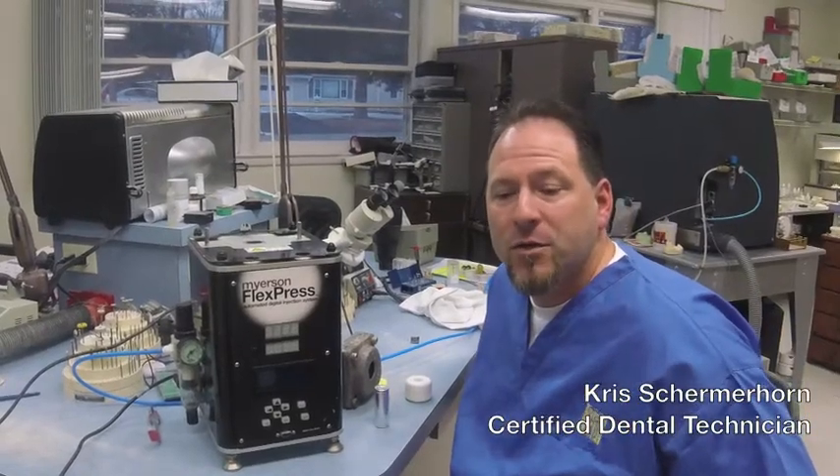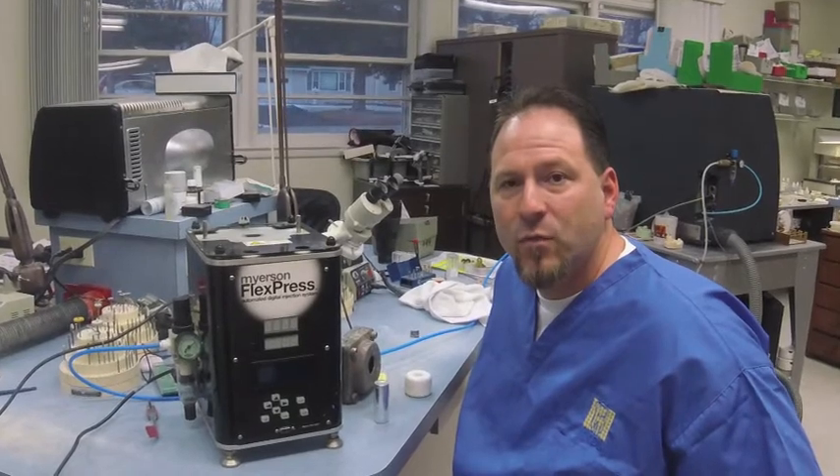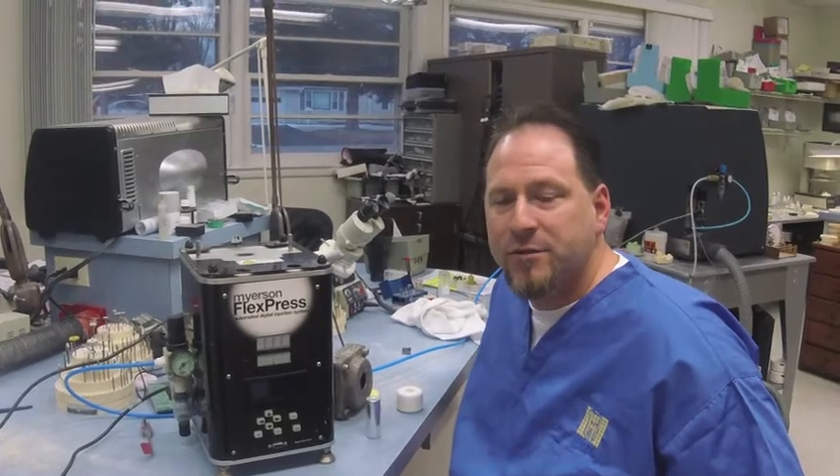Hi guys, Christian Mohorn again. I'm going to go over the introduction to the FlexPress — whenever you guys unpackage it, what you're going to do to run a case through.